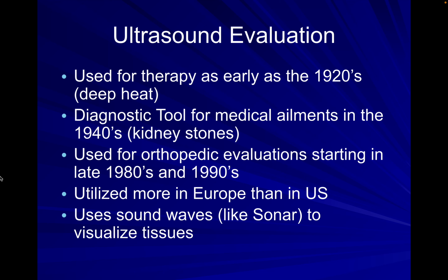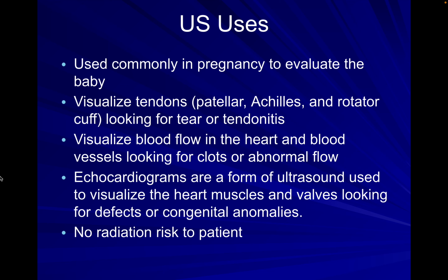And when you get those sound waves, they hit tissue and they bounce back to the ultrasound and produce an image, sort of like how a bat would use sonar. And you may have heard of this, frequently used to look at a developing fetus in a pregnancy.